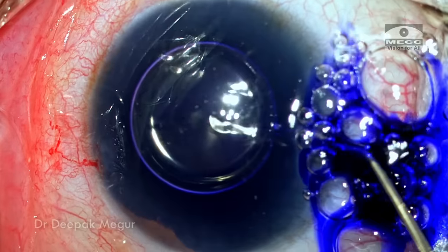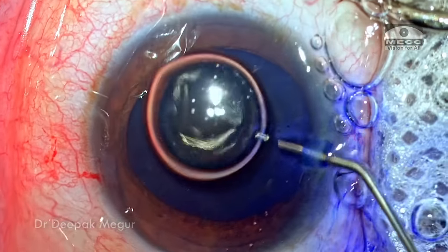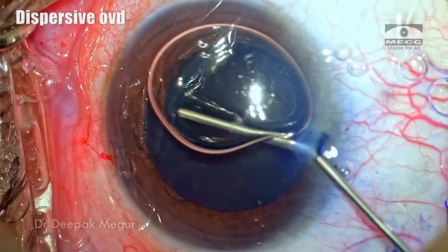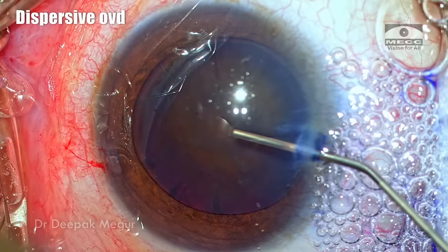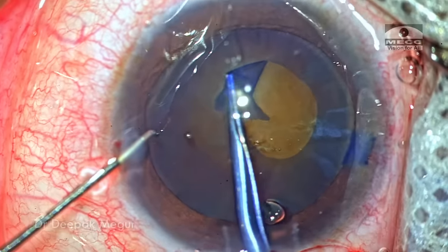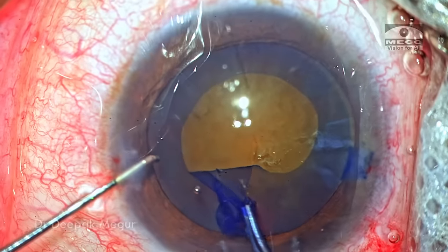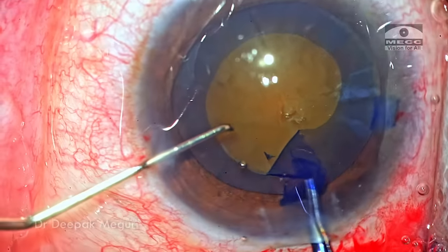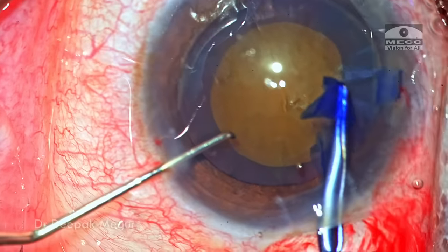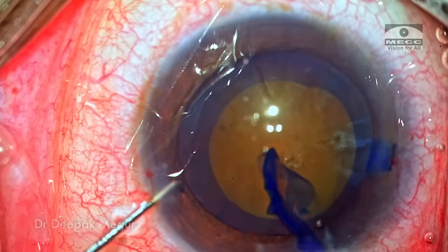The capsule is stained with trypan blue. In these cases visibility is going to be a challenge because of this muddy-looking cataract, so the trypan blue staining does help in identifying the capsule well. The goal is to get at least a 5.5 mm rhexis, because a smaller rhexis is not going to be good for managing this nucleus. I think I've got a decent size rhexis in this case.